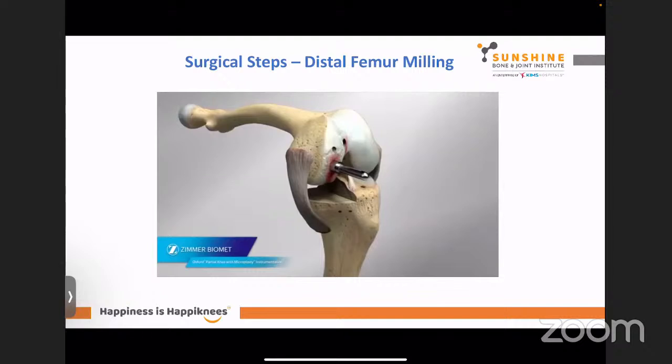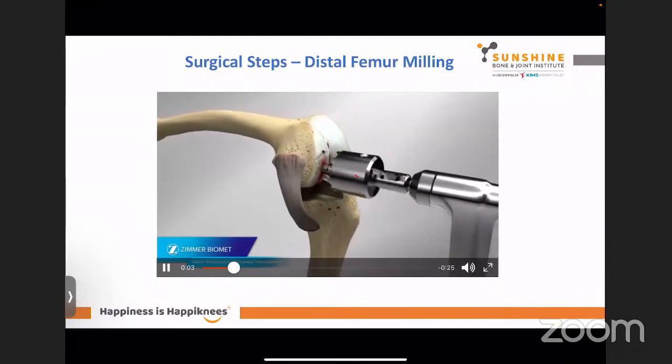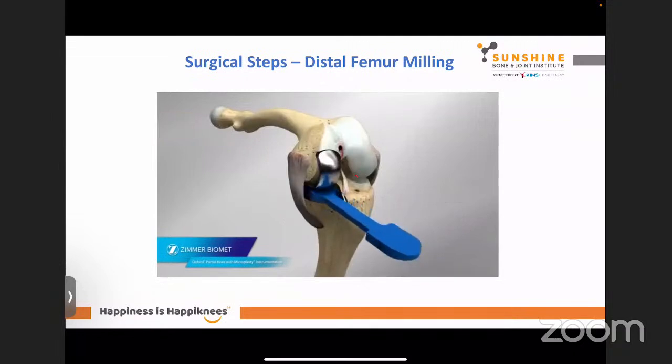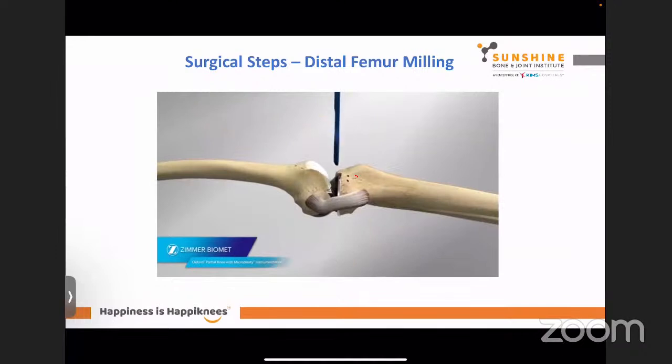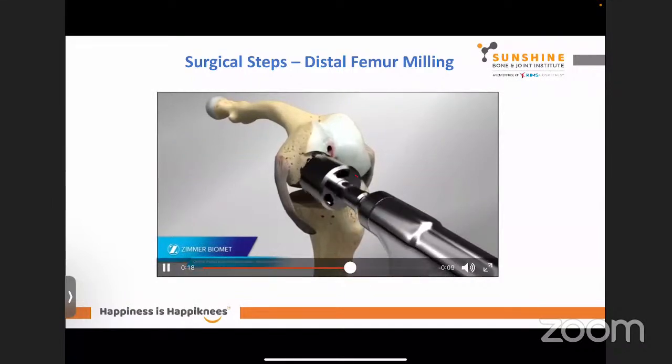But this is not done with a saw like we do in a TKR. We do something called milling. We use something called a spigot. This is called a spigot. It sits into the central peg hole of the femur. And then you get a mill which comes over it and mills out. So see what happens. This goes over, it mills away the distal femur, until your spigot touches that. Then you put in your femoral feeler gauge in flexion as well as extension to see the discrepancy between flexion and extension. So I'm going to show you this again.